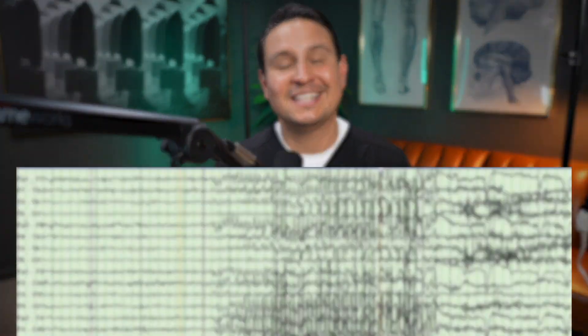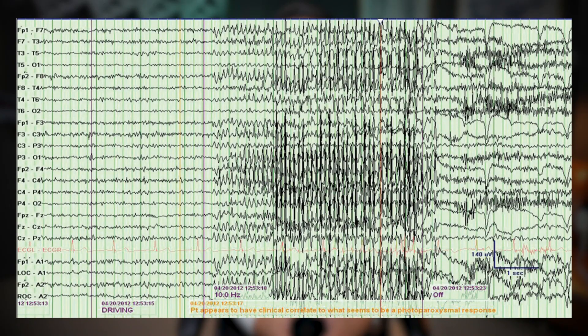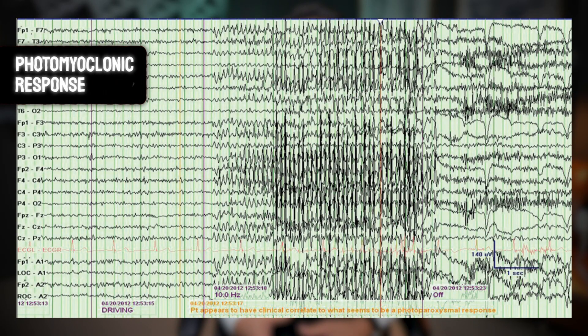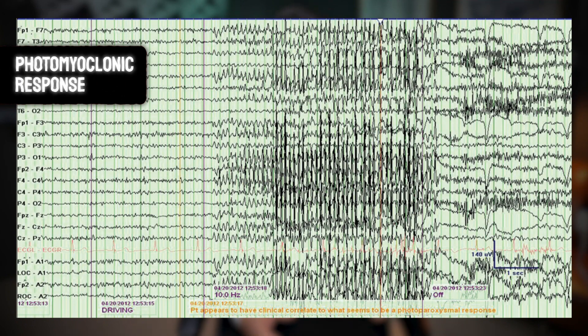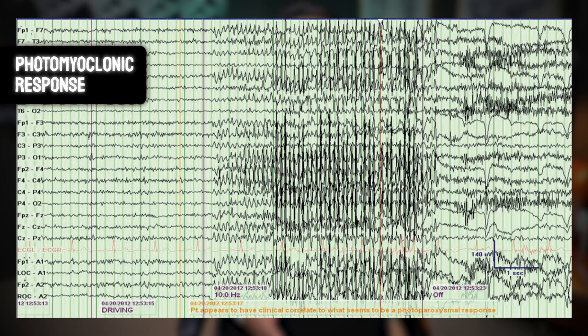When I first started my journey with EEG interpretation, I remember seeing this pattern here — a photomyoclonic response elicited during intermittent photic stimulation. I absolutely thought what I was witnessing was a seizure. However, I wasn't. And here's why.